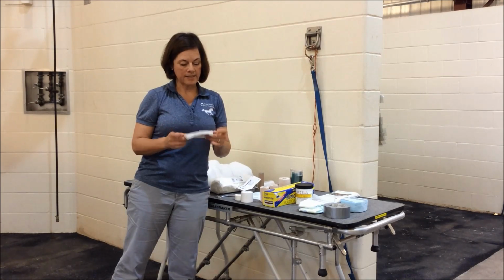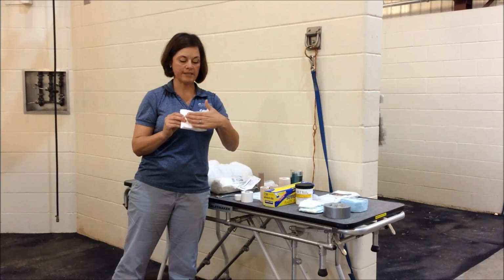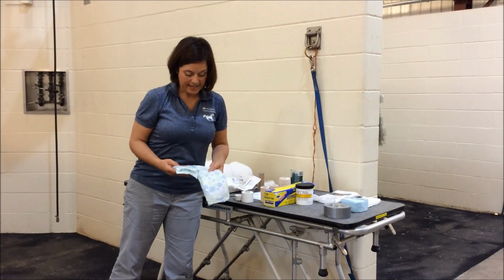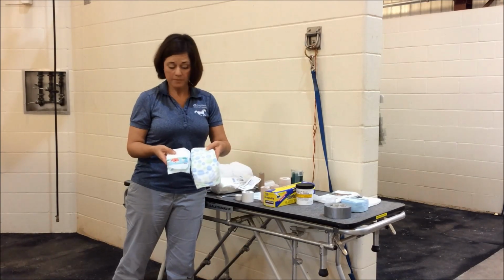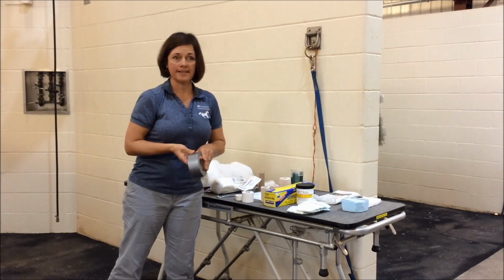The thing to note is that there is a shiny side and a dull side. And when we apply this to the horse, we put the dull side towards the bottom of the foot. We will also use diapers, a variety of sizes. This is a size 1 for little tiny babies or little tiny pony feet, and this is a size 5 for bigger feet. And they come anywhere in between. And then lastly, we will put duct tape on as an outer layer.